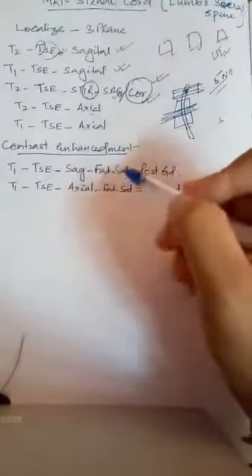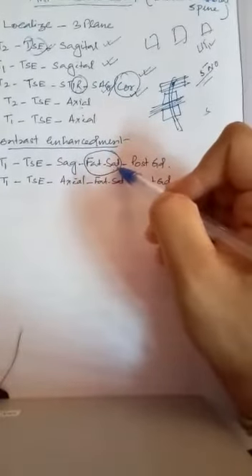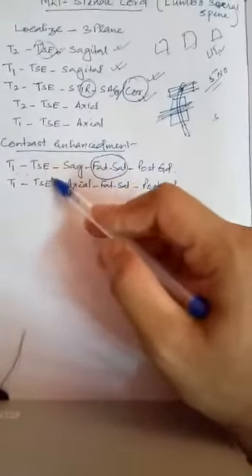then T1 axial. After that, if some finding is there, then we need contrast. For a contrast study, remember always that in any contrast study we have to use the fat set, that means fat saturation or fat suppress sequence. For the fat suppress sequence we are using T1. Only T1 has to be taken for post contrast, that means post gadolinium, we have to use only T1 sequences. That should also be the spin echo.